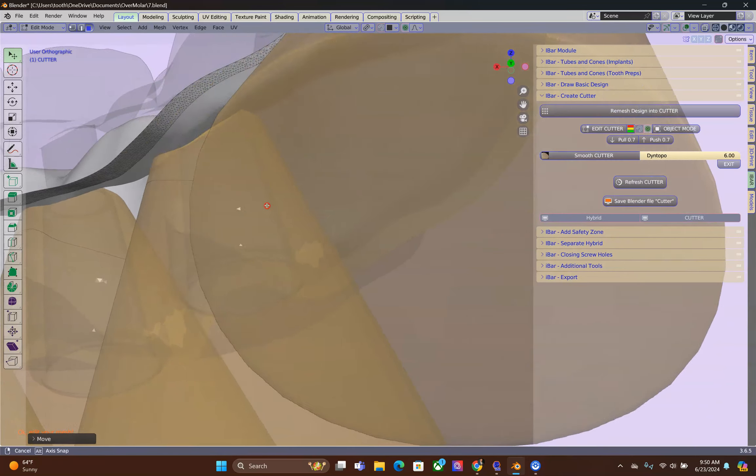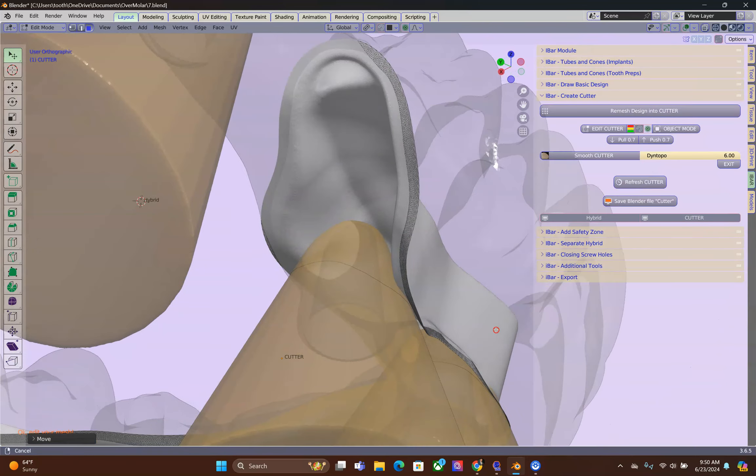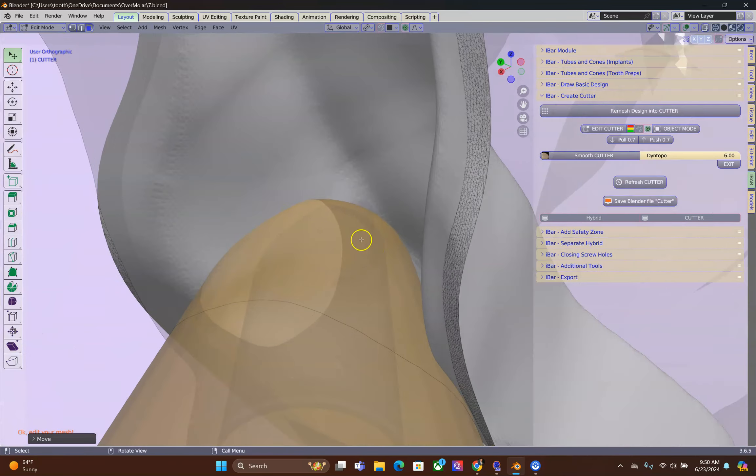Now, because we've moved the cutter inside of the cone, this can create chaos.